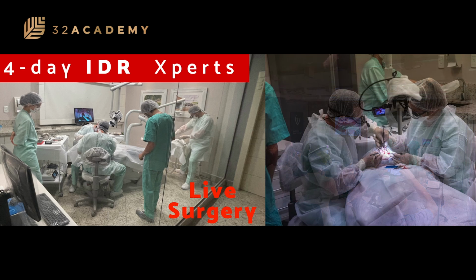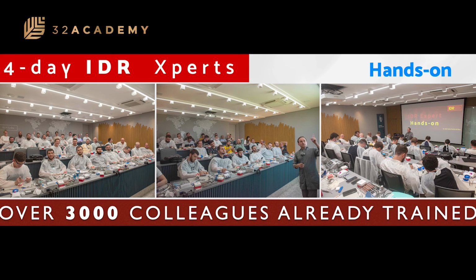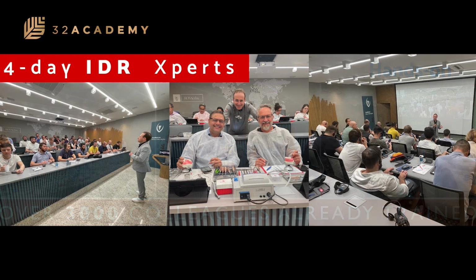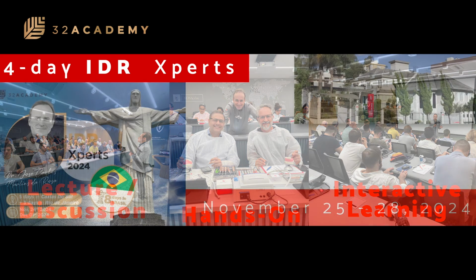Very tough procedures. And here I'm performing the IDR technique. So we have already trained over 3,000 colleagues around the world. During the 4 days, we have the lecture, discussion, the hands-on, and lots of interactive learning. My goal is to teach you in the easiest way possible how to manage compromised sockets and to allow you to apply this technique in your daily practice the following day.